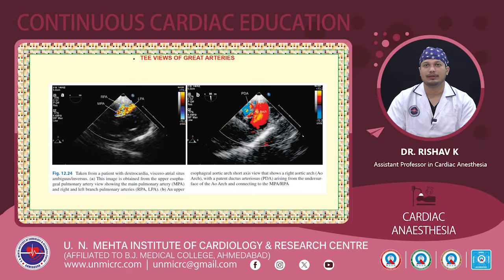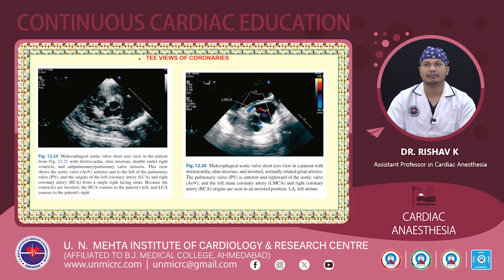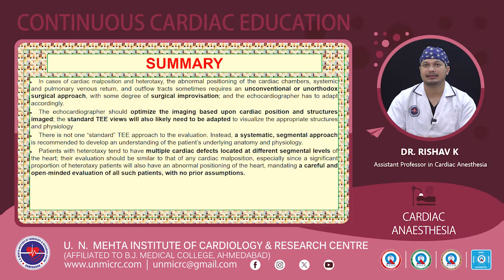Also, the image on the right side is an upper esophageal aortic arch short axis view showing a right aortic arch, with a vessel arising from the undersurface of the aortic arch and connecting to the main pulmonary artery or the right pulmonary artery. Coming to the mid-esophageal aortic valve short axis view in the patient with dextrocardia, situs inversus, double outlet right ventricle and subpulmonary pulmonary valve stenosis. This view is showing the aortic valve anterior to and to the left of the pulmonary valve and the origins of the LCA and the RCA from a single right-facing sinus. The image on the right side is showing the origin of the LMCA, that is the left main coronary artery, in a patient with dextrocardia, situs inversus and inverted normally related great arteries.